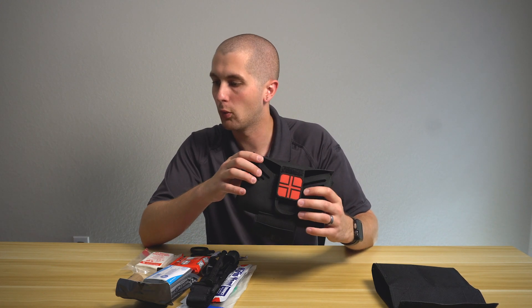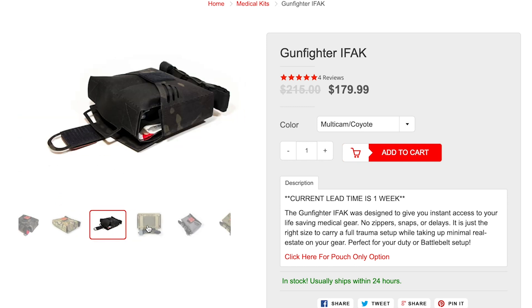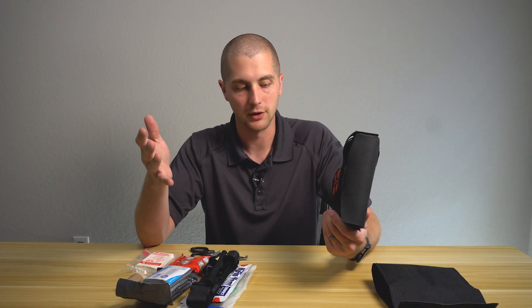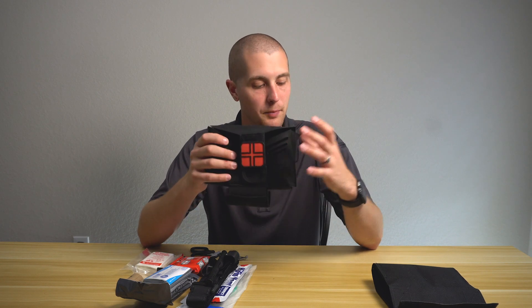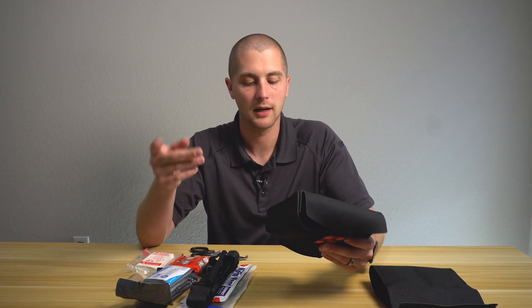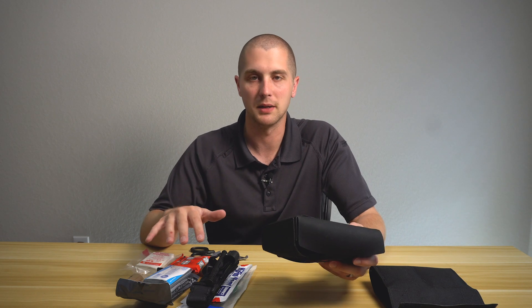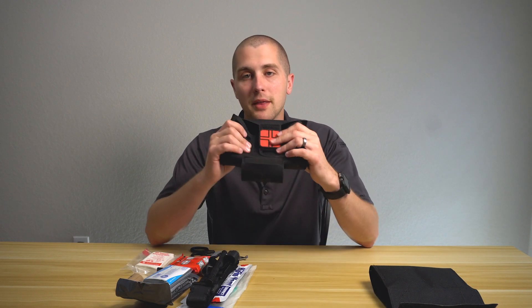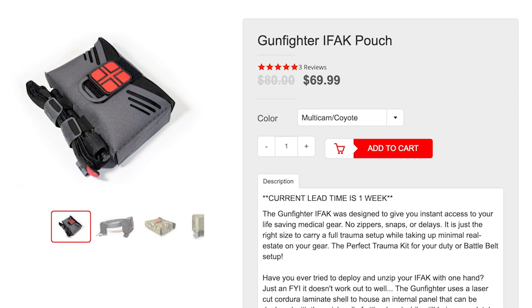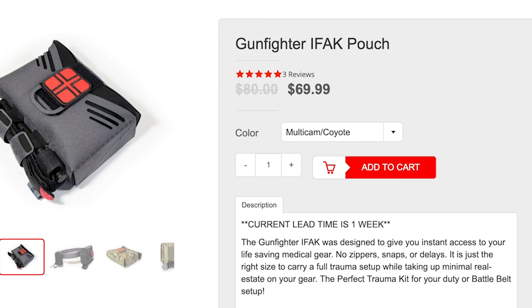This kit is a little bit pricey — it will run you about $179 online. I do have a 10% discount code you can use. I don't get any money from these guys, but I do think they're a good company. What you're paying for is a quality kit with supplies that are already curated for you. If you go out and buy these supplies separately, you will save a couple bucks. However, I kind of like buying these full kits because they come ready to go and I don't have to think about it. If you want to buy the bag on its own, that's going to cost you about $70 — marked down right now from $80 plus — and you can get another 10% off with the code.